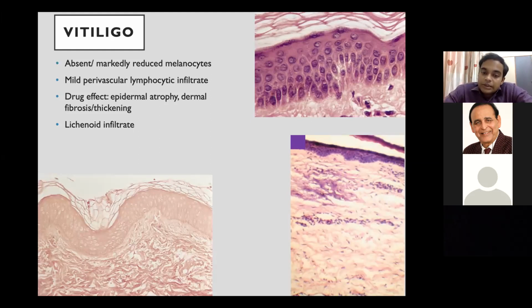In those cases, unstable vitiligo changes will be seen in dermoscopy. So in those cases only, histopathological changes will also be seen. Otherwise, they are not very common. It will look like a normal epidermis, one or two scattered melanophages, and then that's it. No dermal findings. So you will be looking at a blank slide, totally invisible, unless you see the biopsy form.